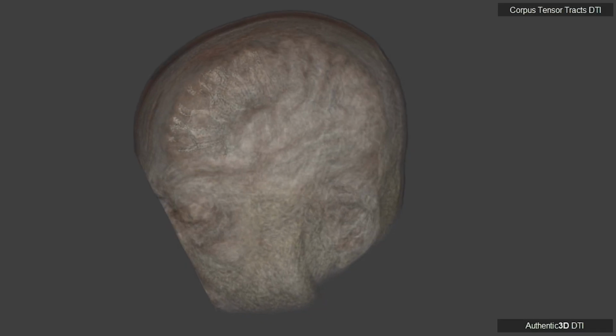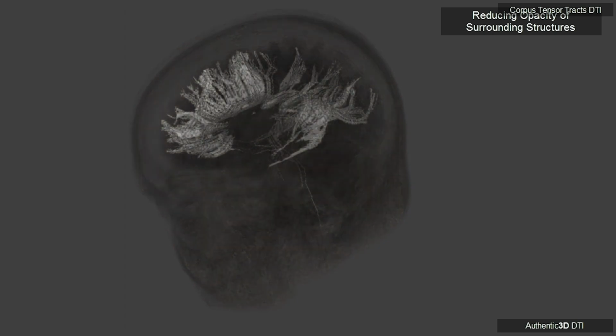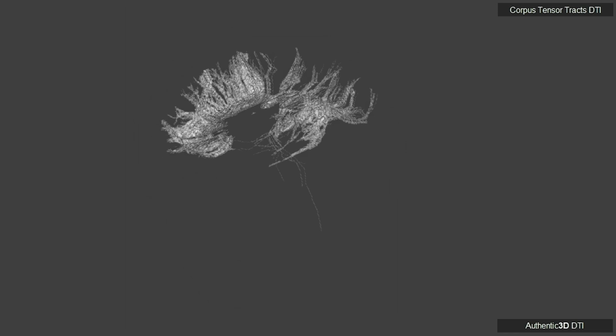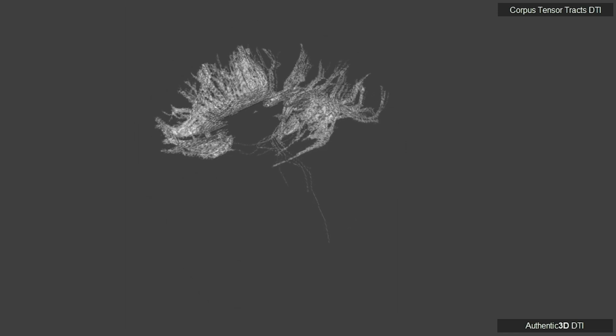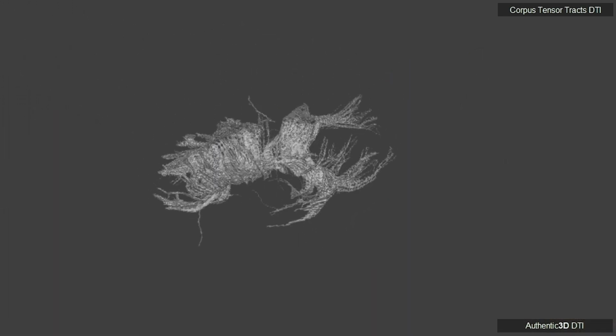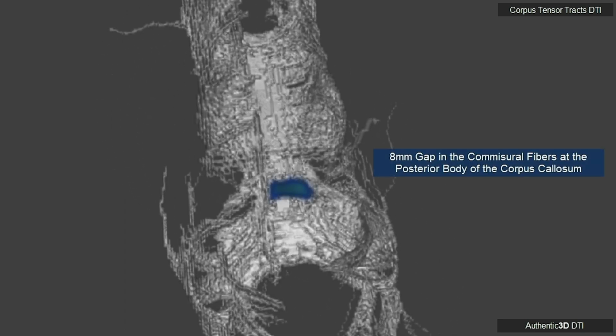In one case, we had an MRI that looked largely normal, and we ended up with a DTI that showed a large hole in the person's corpus callosum, which is essentially the communication center between the right and left lobe. This is a client who worked at a very high level for a large corporation, communicating and doing things in multiple different countries, and she had great difficulty doing that type of complexity afterwards, and eventually had to resign from her job as a result of the traumatic brain injury. That would have been missed had we not done the DTI.